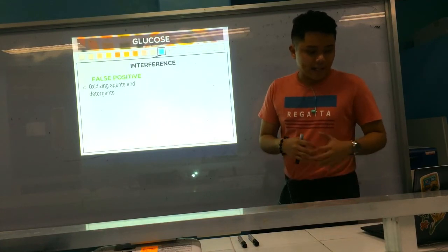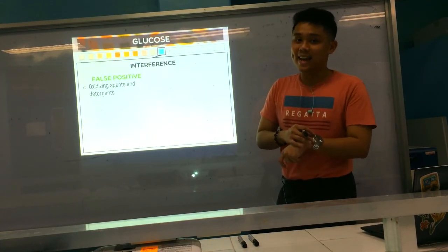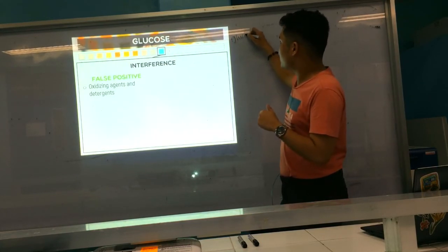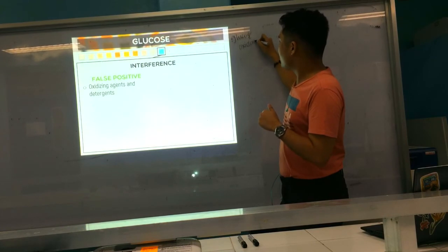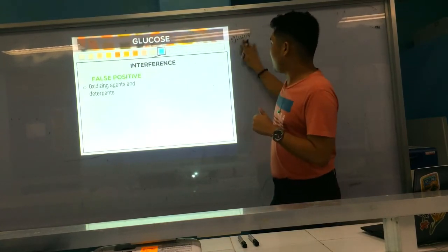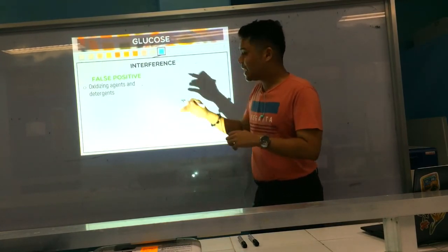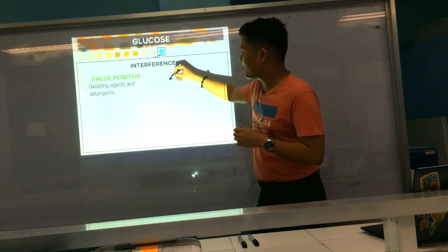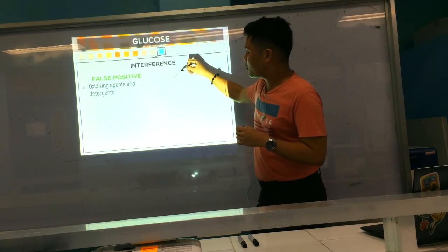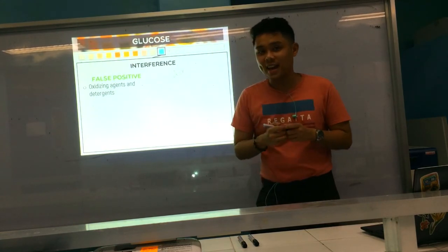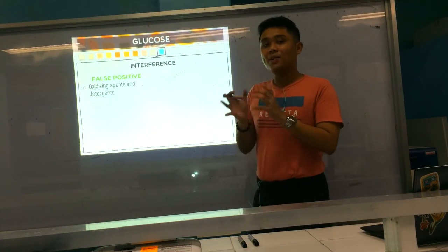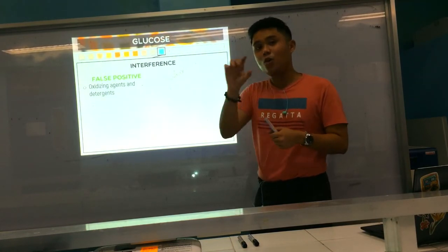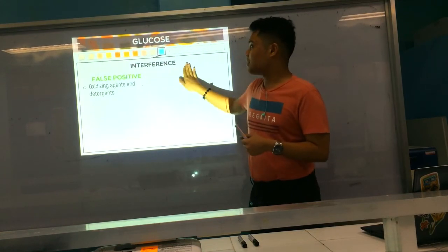Detergents and bleach are good oxidizing agents. Recall that the first enzyme is glucose oxidase. These oxidizing agents intensify or magnify the effect of glucose oxidase, causing a false positive result. They increase the activity of your first enzyme in the reaction.